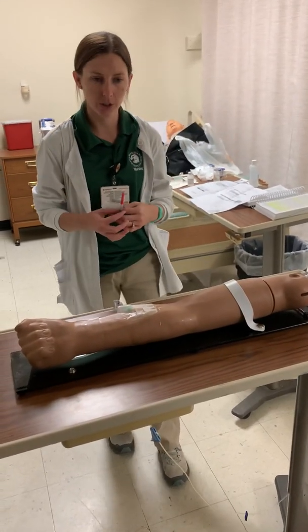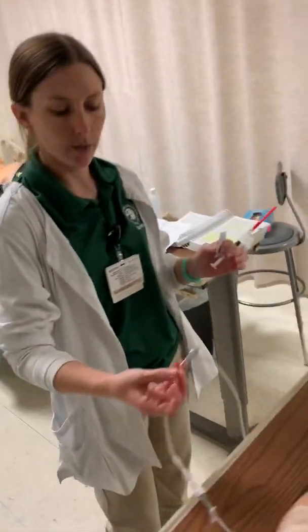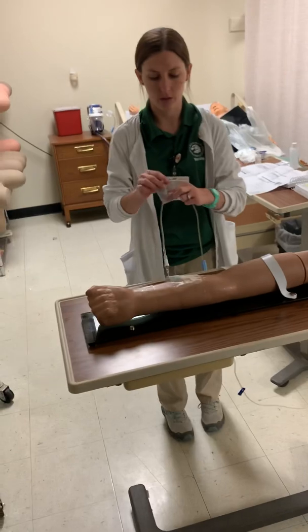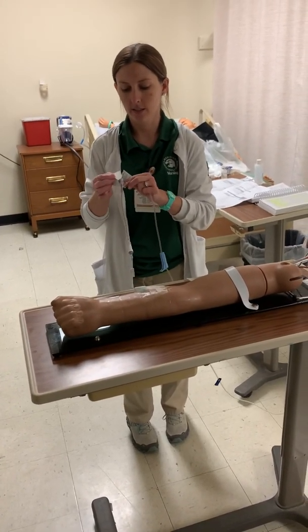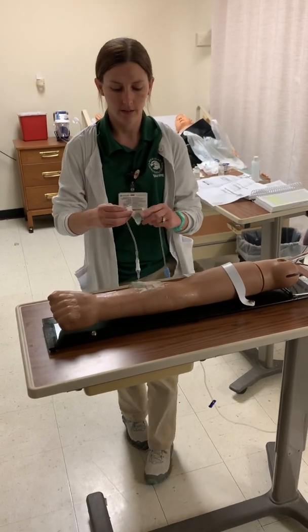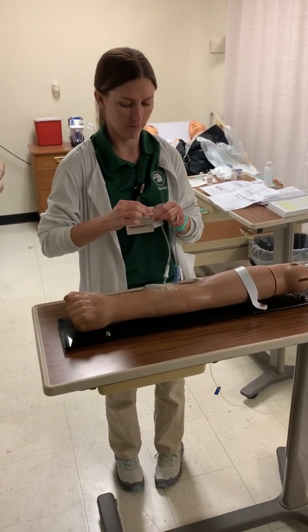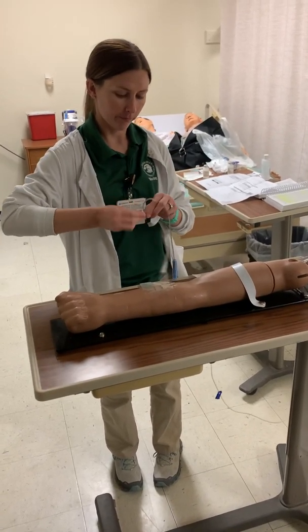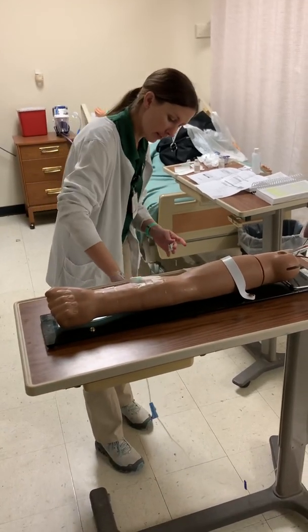The hub that we want to use for this IV push is the hub that is the closest to our patient, so it's going to be this hub here. So we want to clean this for 15 to 60 seconds. Okay, and being careful not to contaminate it.